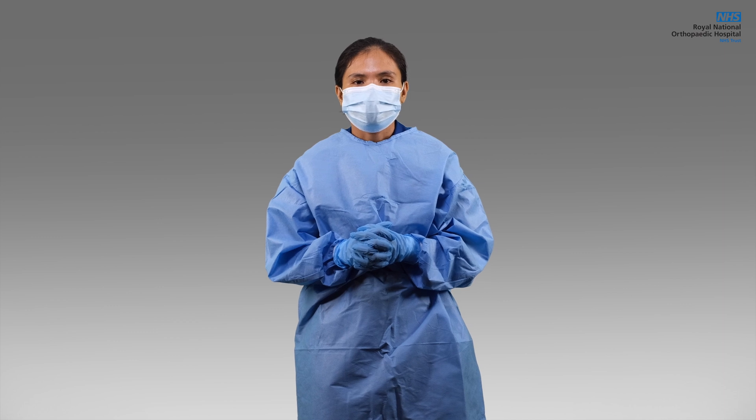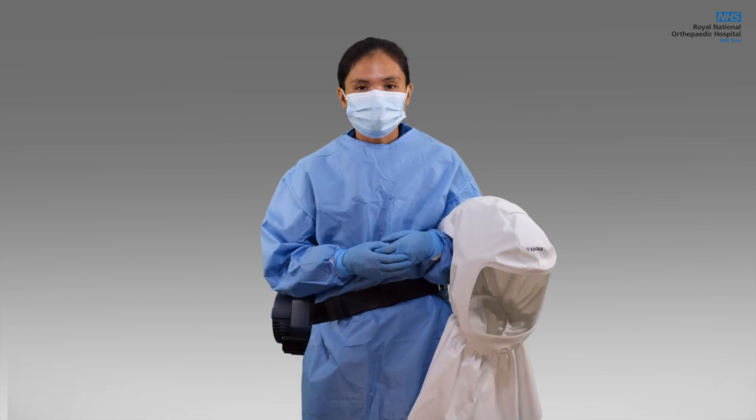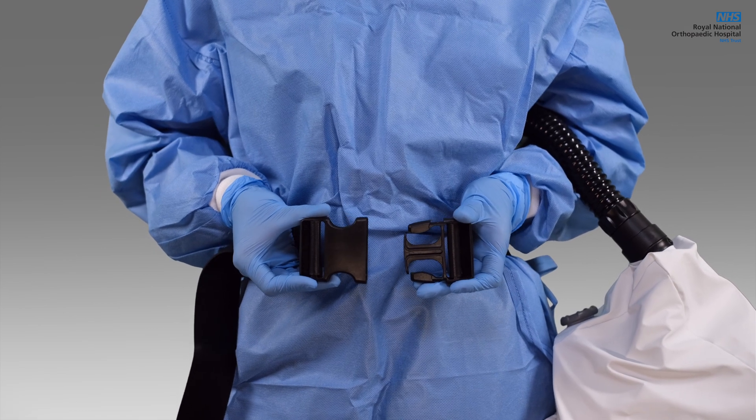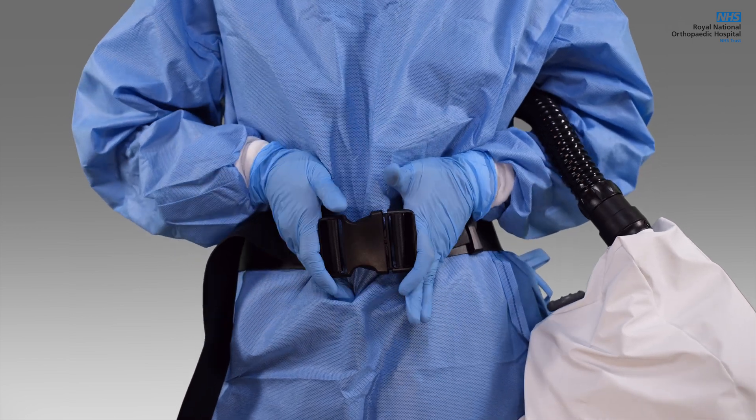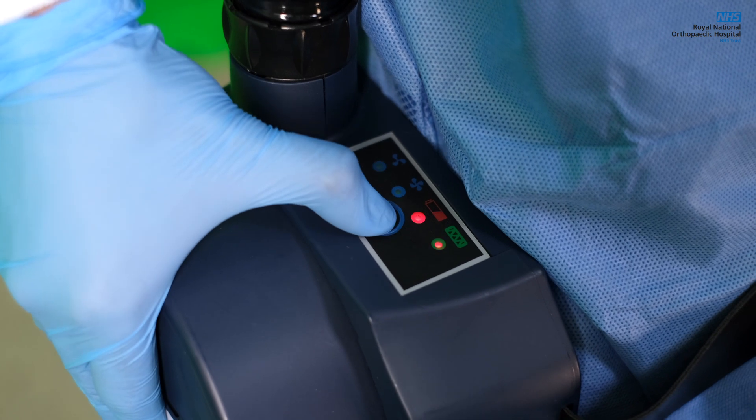To wear the device, make sure you are already wearing the proper PPE. The powered hood will be worn on top of your gown. Adjust the belt according to the wearer's fitting. Put it around your waist and then connect the buckles. To switch on the unit, press the red button on the control panel.